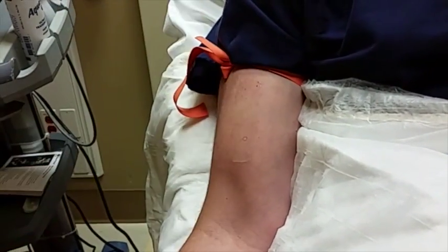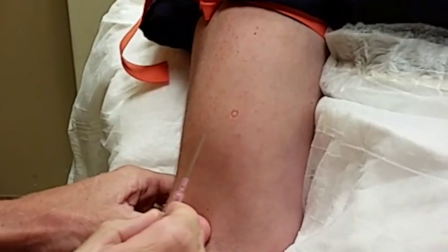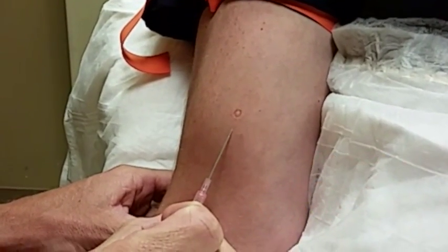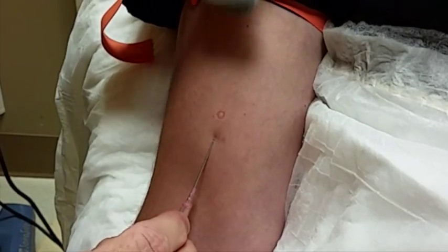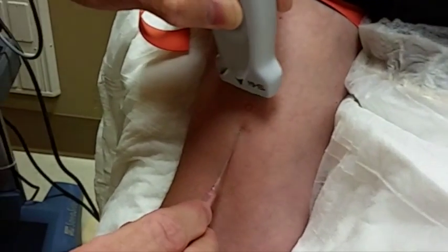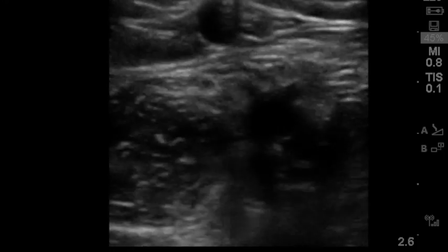Put the probe away, wipe off all of the ultrasound gel, prep the skin, and advance the catheter. Remember, you will be entering the vein at the mark, so enter the skin about a centimeter or so distal. If you go in and are struggling to find the vein, bring the probe back and set it a centimeter or so away from your insertion site so as not to contaminate it, then watch the IV go into the vein.